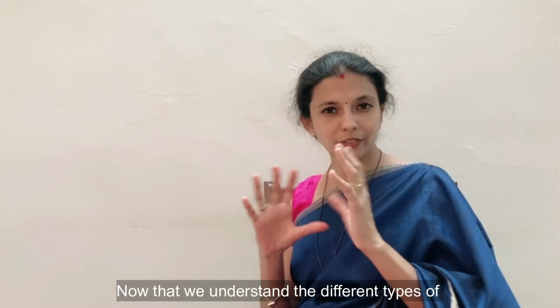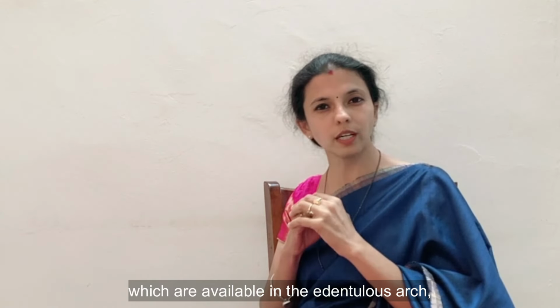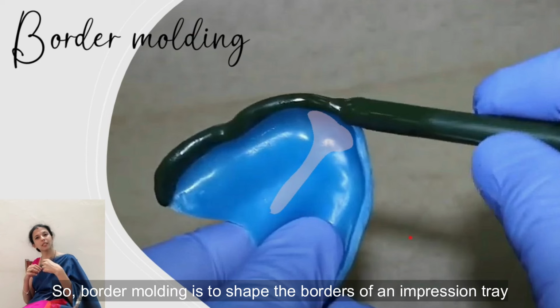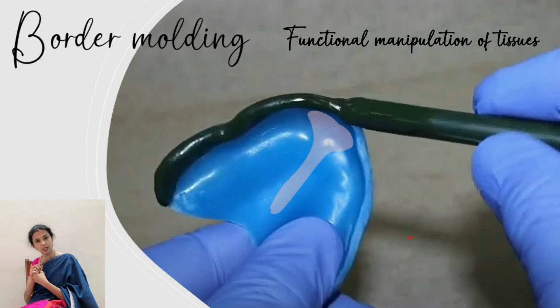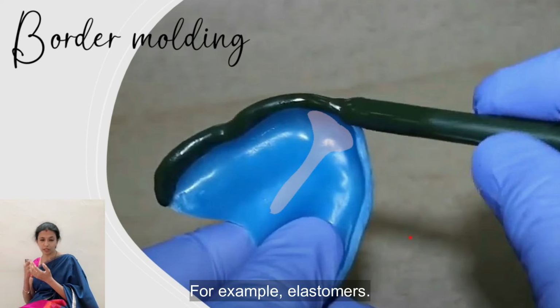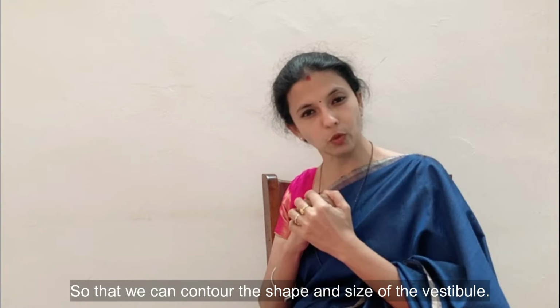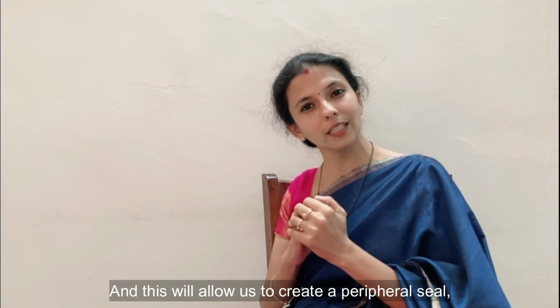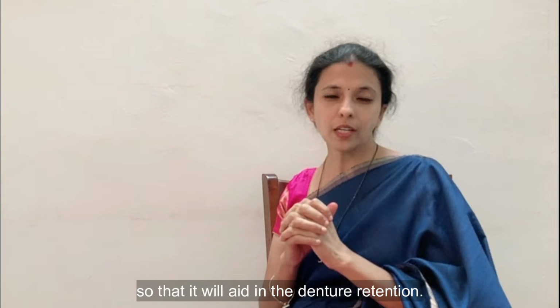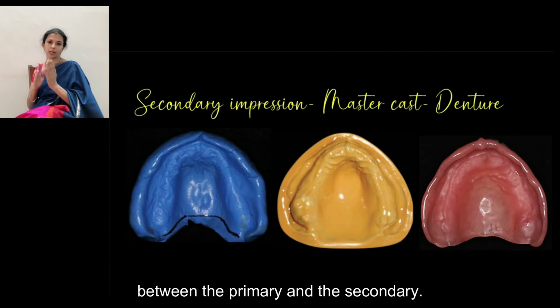Now that we understand the different types of the denture bearing areas which are available in an edentulous arch, we can define border molding. Border molding is to shape the borders of an impression tray by using any kind of material like a low fusing compound, for example, or elastomers, so that we can contour the shape and size of the vestibule, and this will allow us to create a peripheral seal so that it will aid in the denture retention.